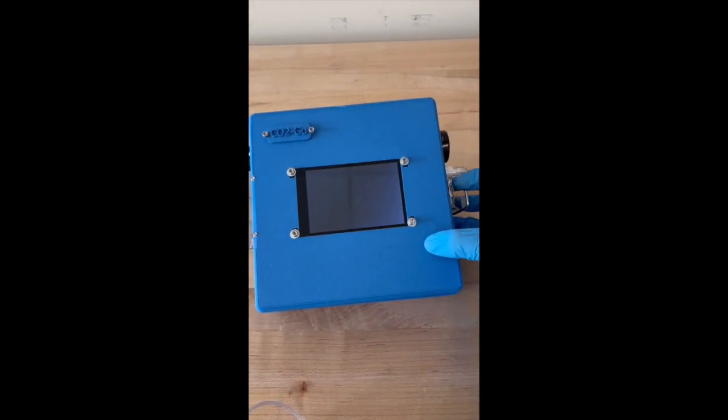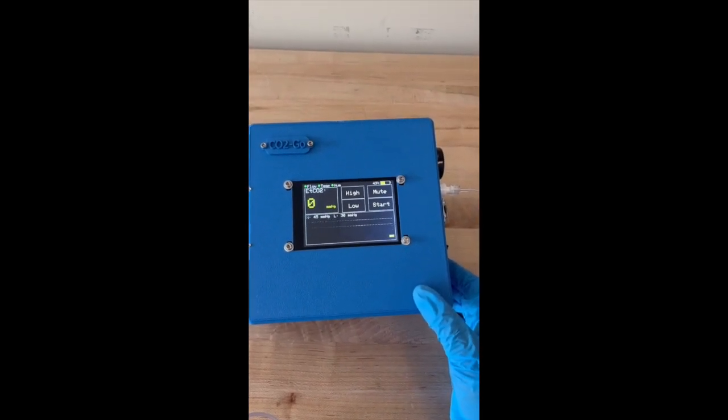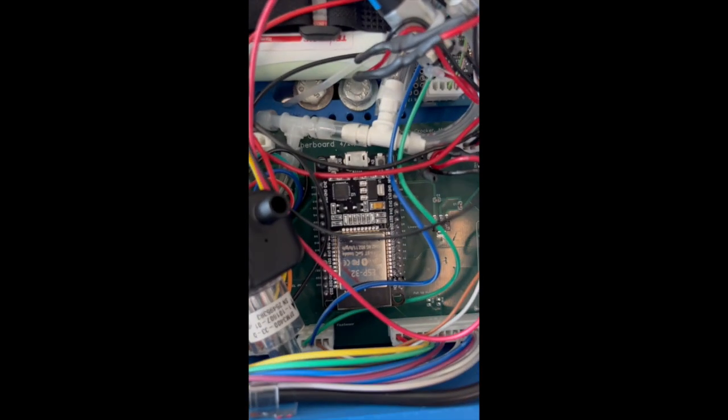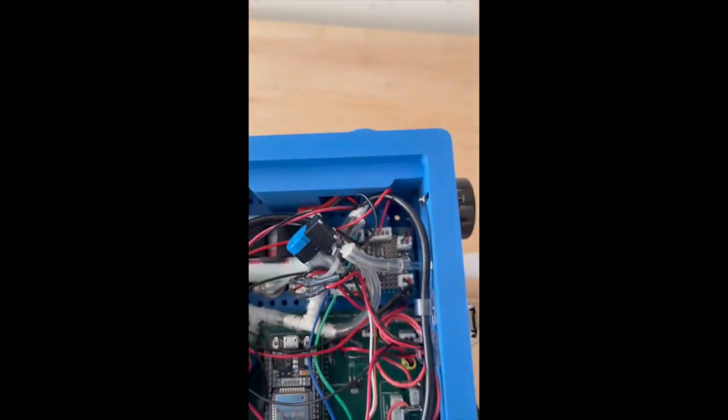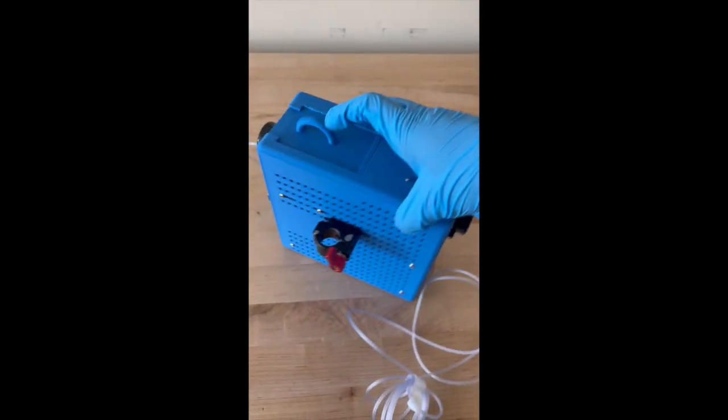If you switch the device back on by just simply pressing the switch and closing the toggle latch, it's good as new and ready to keep going. Now taking a look at the electronic components outside of the pneumatic workflow, we have the ESP32 connected to the PCB, the battery, and the protoboard that enabled us to actually interface the flow sensor, which is a major challenge for us for a long time.